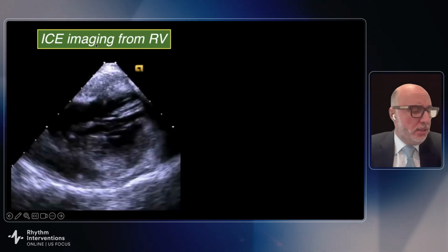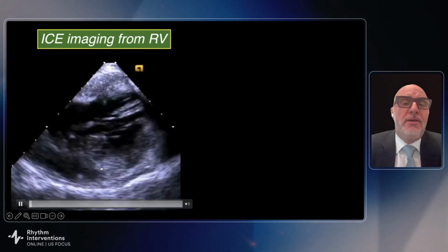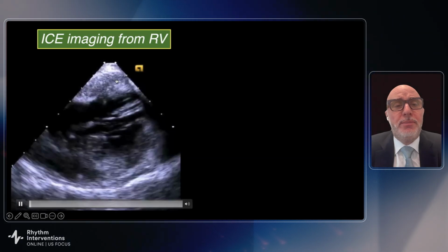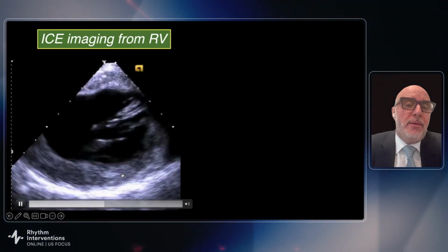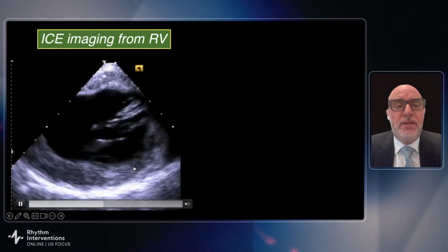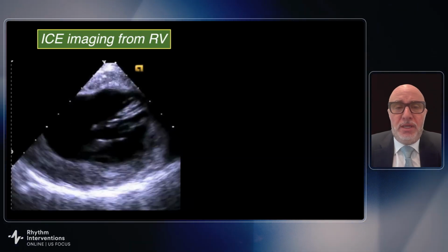This is a standard image, viewed from the right ventricle. If you're interested in this area, the farthest area from the imaging probe, you have to go through the septum, especially if the patient has a pacemaker or ICD, and try to focus here. I had ventured to say that maybe there might be something down here in the left aspect of the left ventricle, but overall, nothing jumps out in the picture.